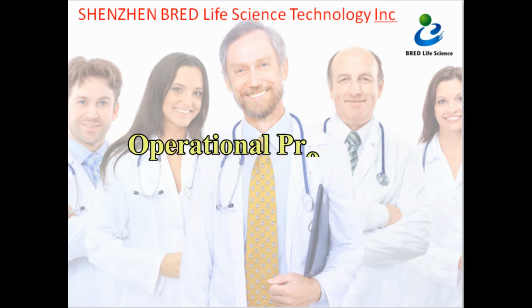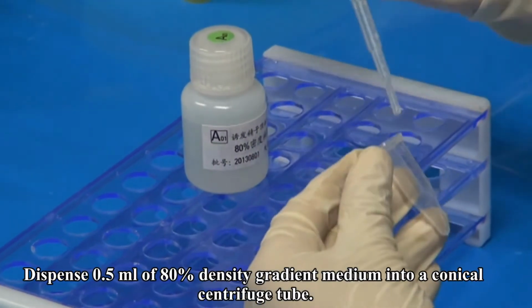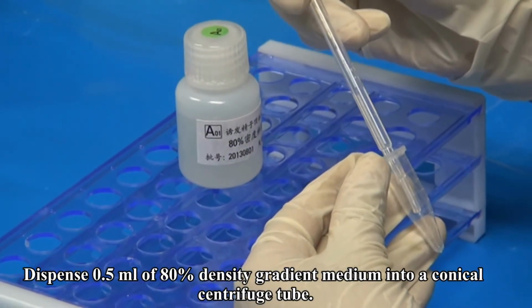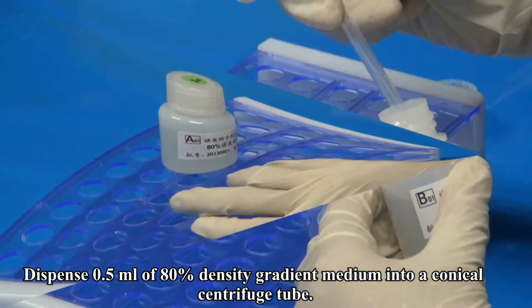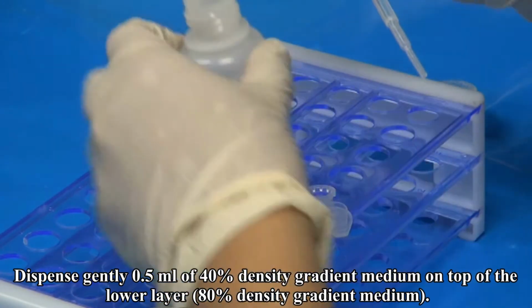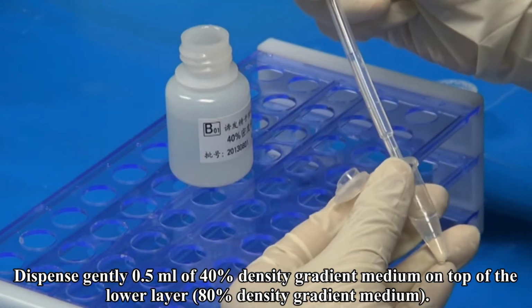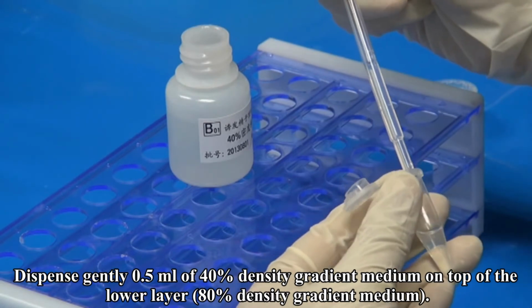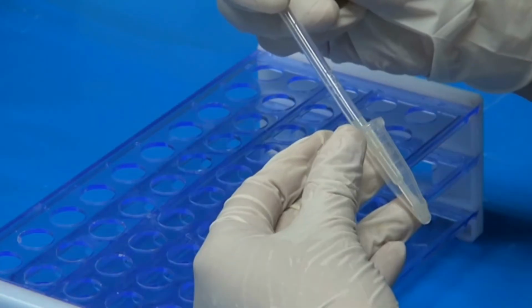Operational process: collect motile sperms by density gradient medium. The method is as follows. Dispense 0.5 ml of 80% density gradient medium into a conical centrifuge tube. Dispense gently 0.5 ml of 40% density gradient medium on top of the lower layer, 80% density gradient medium. Be careful not to disturb the interface.